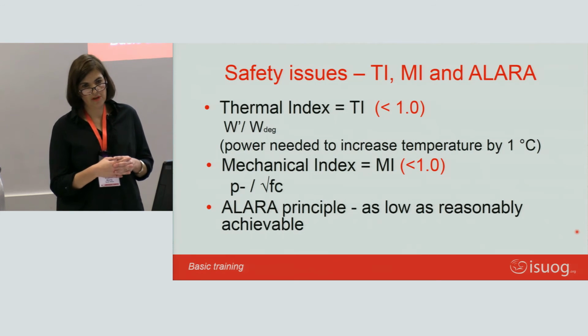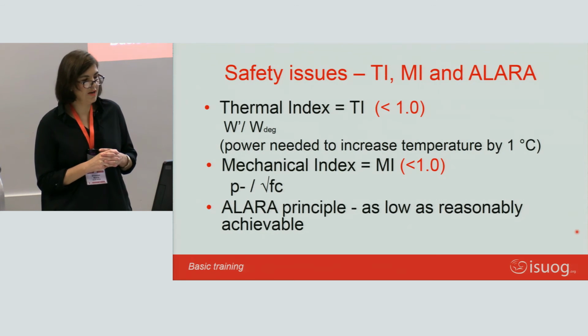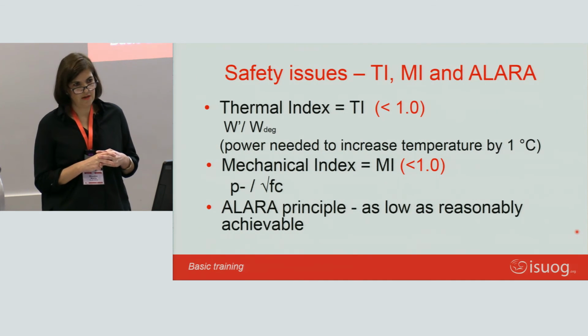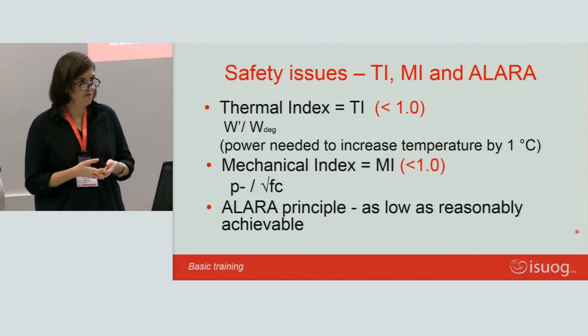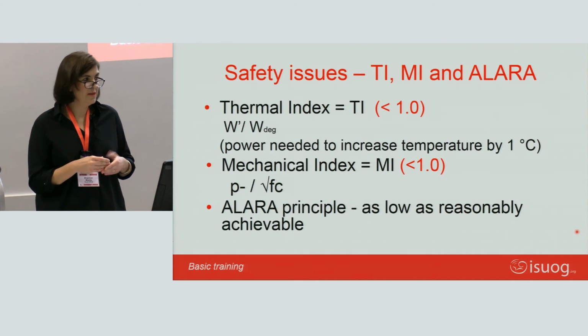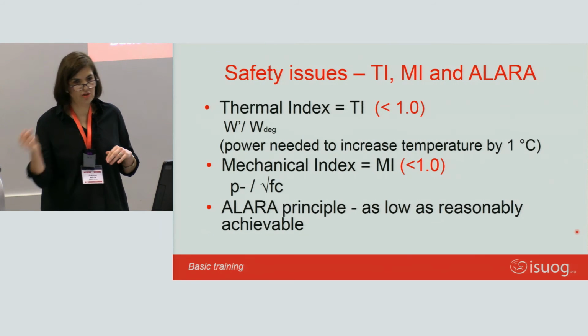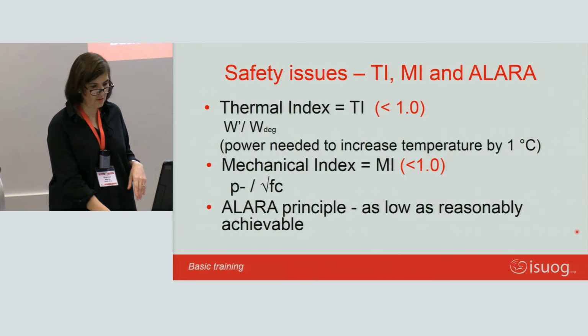And the ALARA principle is very important. It means that you need to scan with as low energy as possible for the reasonably achievable time to answer the clinical question that you are looking at. So, if you're doing an anomaly scan, you need to scan for as long as it takes for you to measure all the things you need to measure, check where the placenta is, the fluid, and do the anatomy. It is not a good idea to do fun scans, just to have a look at the baby. The reason for scanning is to answer a clinical question.